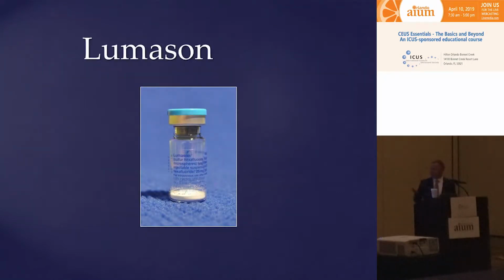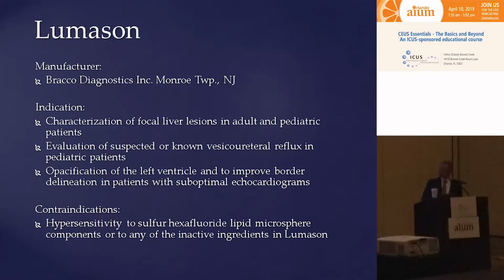Lumason is a very commonly used agent on the market. It comes in this dry powder at the bottom of the vial, manufactured by Bracco Imaging. Those are the indications that you can find on the insert of this agent.